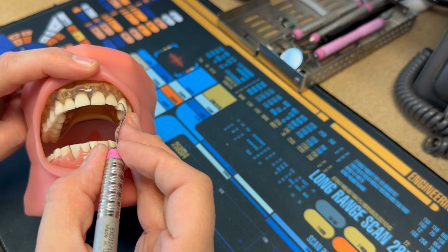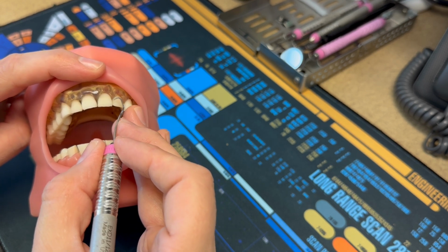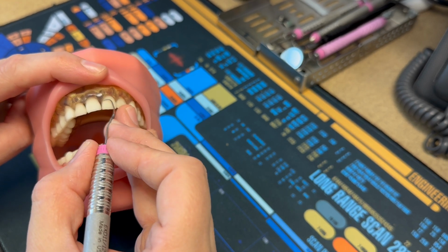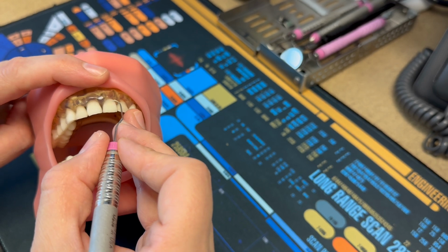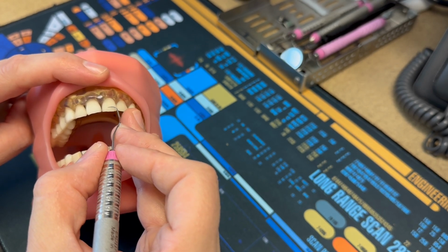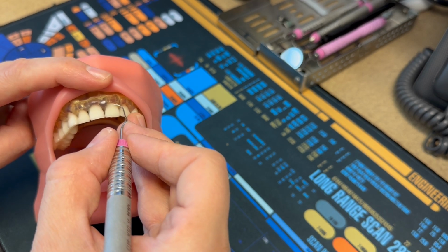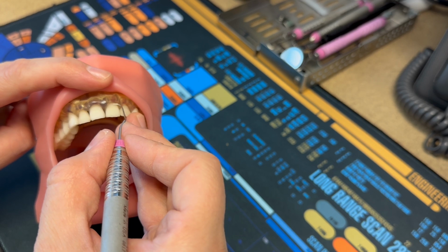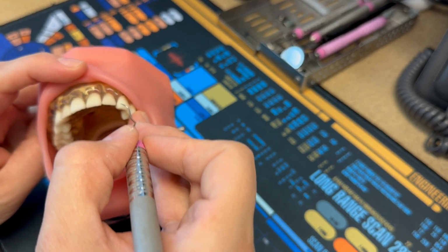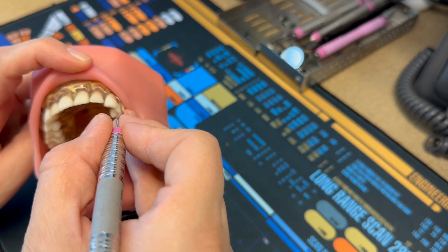And as you work towards you in your towards position, just ensure that when you're performing your strokes, you are starting at that midline. So remember, the working end for this instrument is going to be the 1 to 2 millimeters of your tip. Okay, so ensure that that tip is starting at your midline of the tooth. Okay, so on the canine, I'm going to turn my patient towards me a little bit. It's going to be about here.